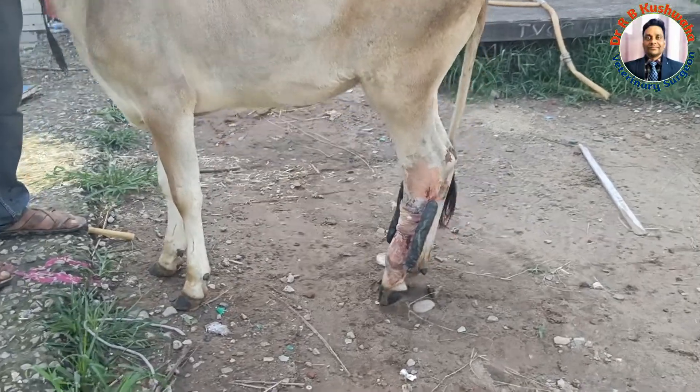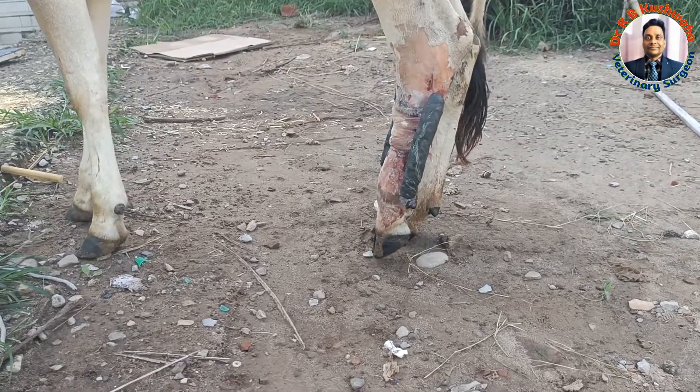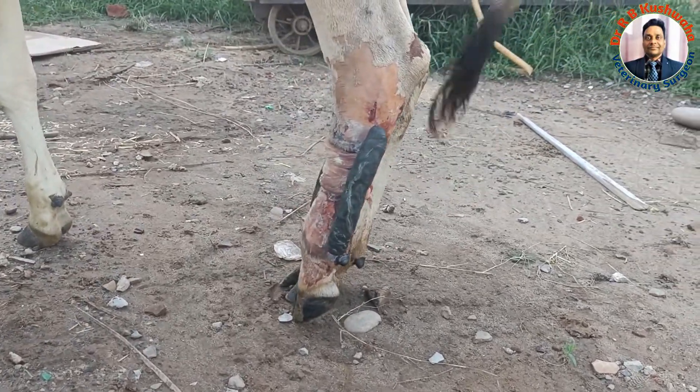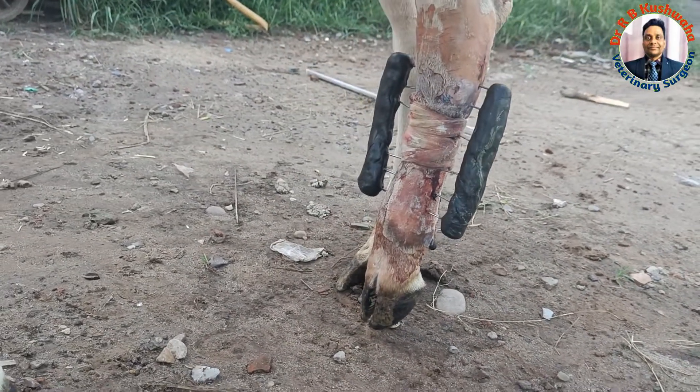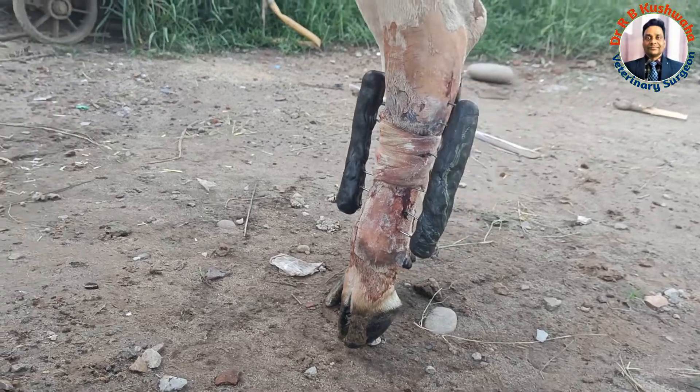If you see from the lateral side as well as from the anterior or dorsal aspect, or even the plantar aspect — so from all sides, the anatomy of this metatarsal bone is well restored.